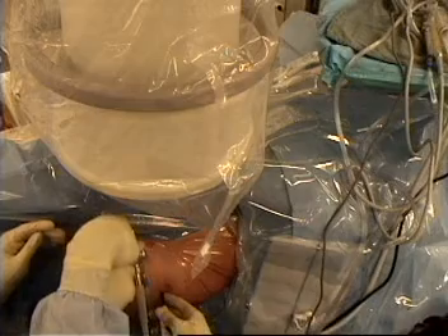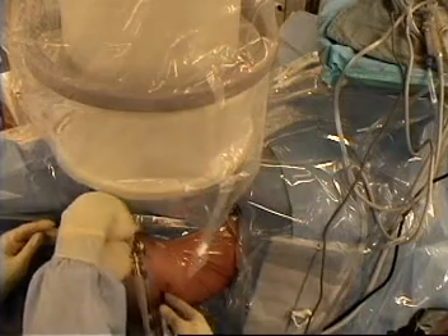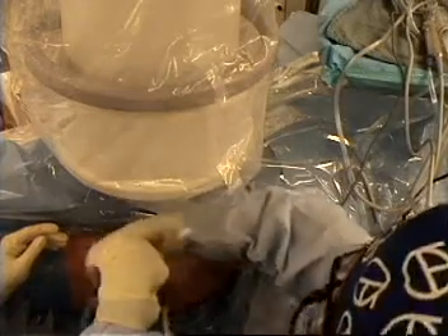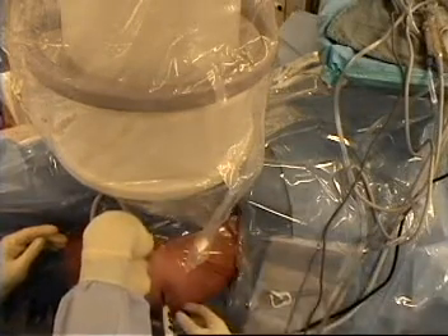You can see there is synovitis in that one. So that is the one that we actually need to go fix — the front one. So what we are going to do is come down here and make sure that this one is okay.